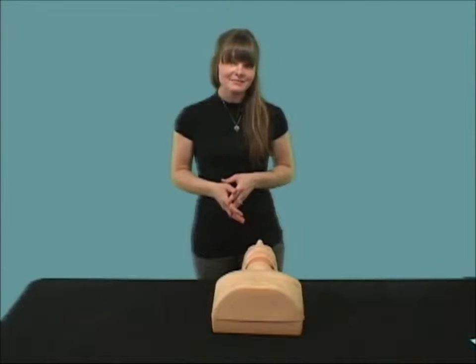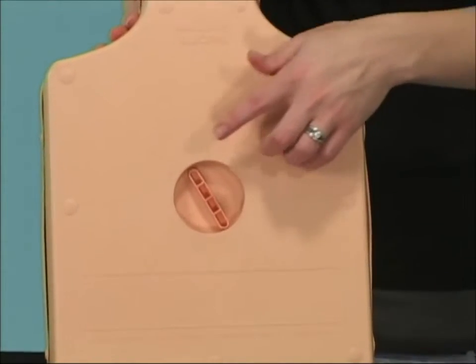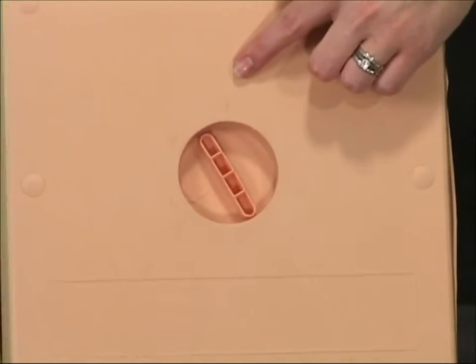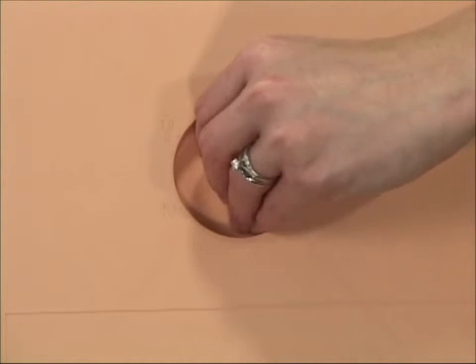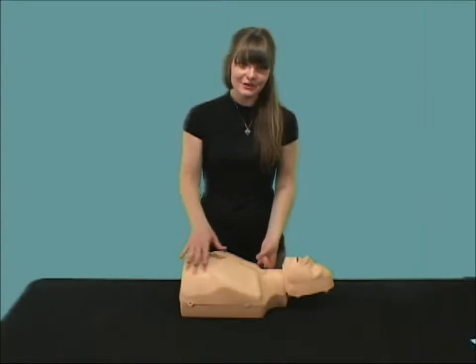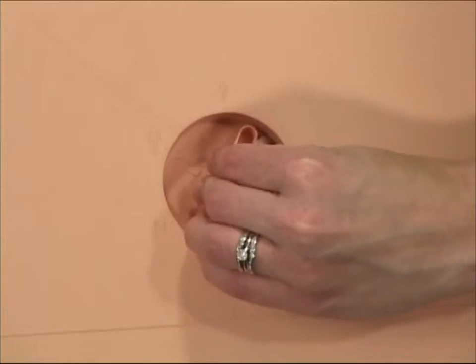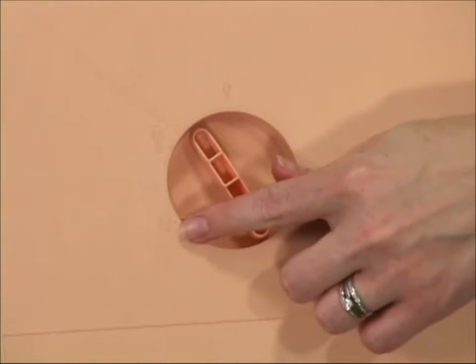Now you're ready to train. Let's see how to use the PractiMan. The selector on the back determines the depth of the compressions for an adult or child, which is confirmed by a clicking sound. If you prefer not to hear a clicking sound, all you need to do is turn the dial to neutral to disable the clicker.